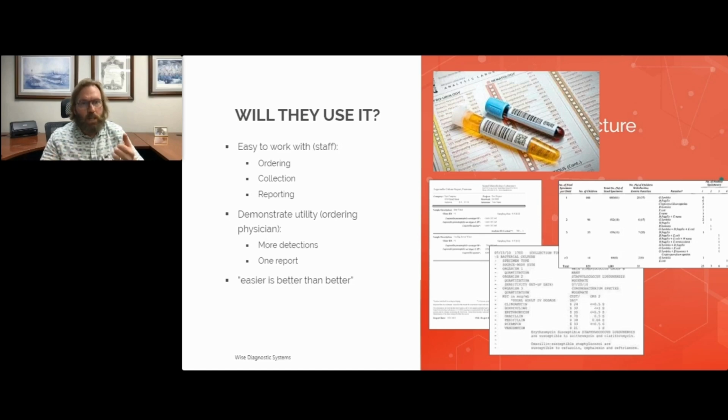So the doctor's waiting on that result to make a decision. The staff has to keep up with tying 2 or 3 different reports to one lab order, whereas in this type of testing, it's all in one. And typically, if you do it the way that we do it with using an overnight service, if they collect a specimen today, we'll get it in the lab tomorrow and report it out that same day. And so from the staff's perspective, they say, I get this sample from the patient today. I really only have to worry about it tomorrow, and I should have the result in there.